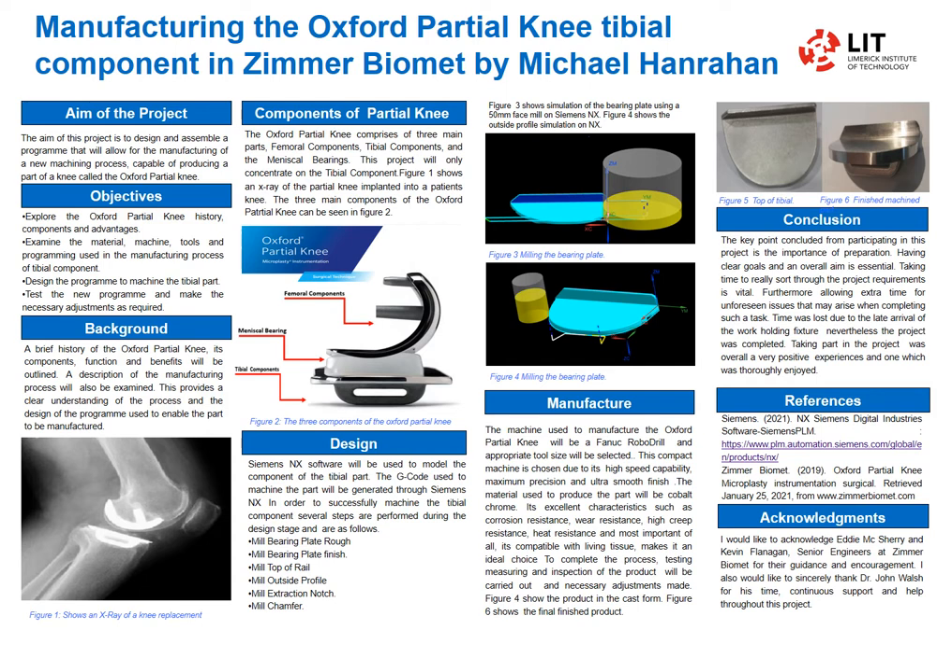As we can see in Figure 3 and Figure 4, these are clips taken from my NX. Figure 3 is the face milling using a 50mm face mill. Figure 4 shows the outside profile using a 60mm end mill.